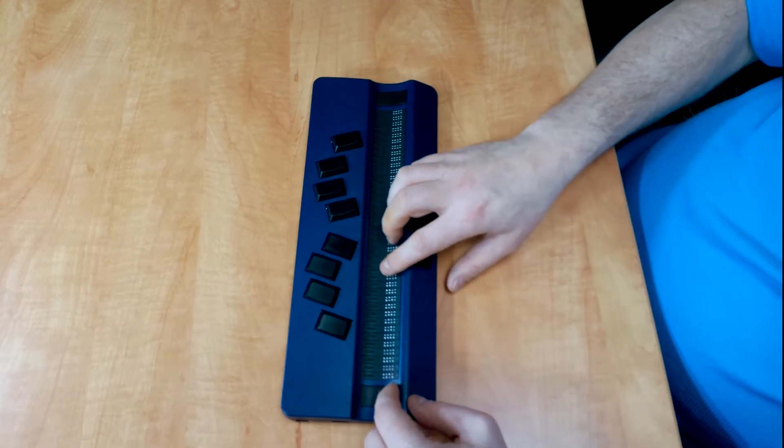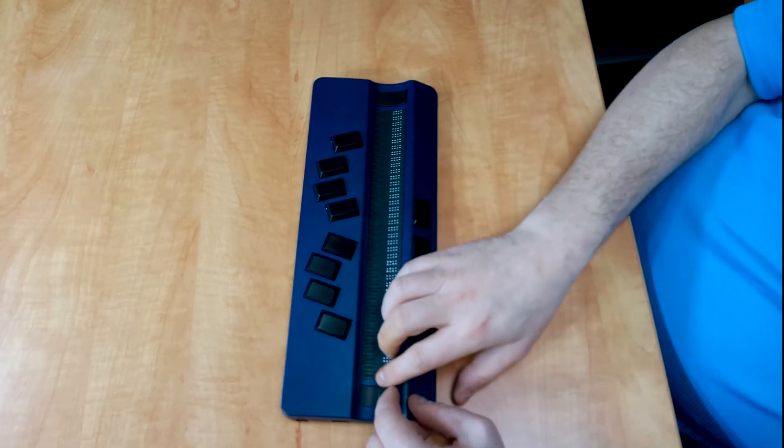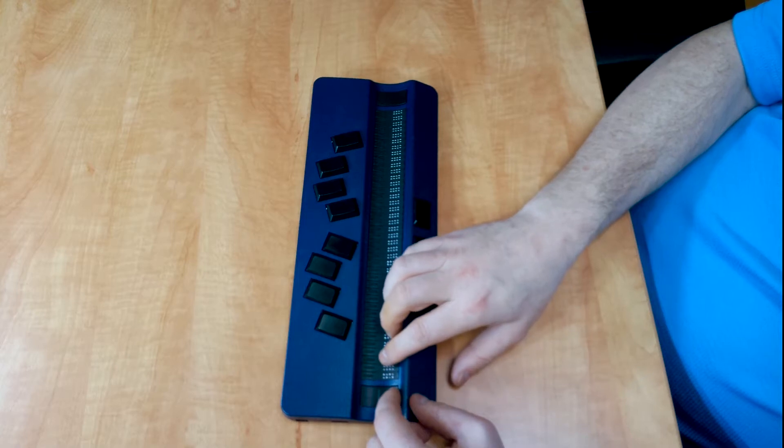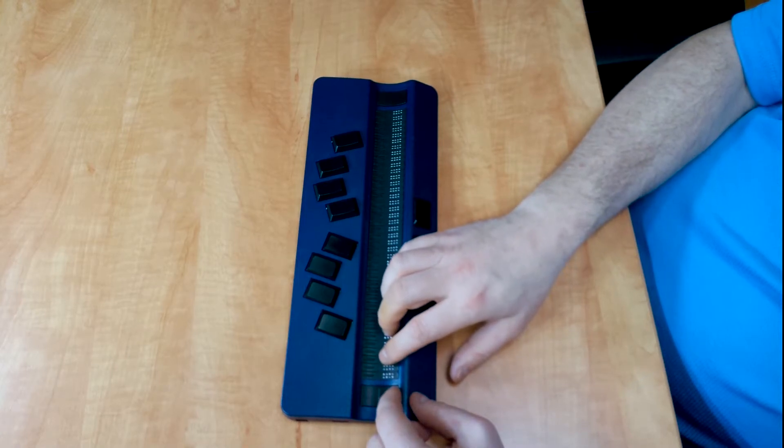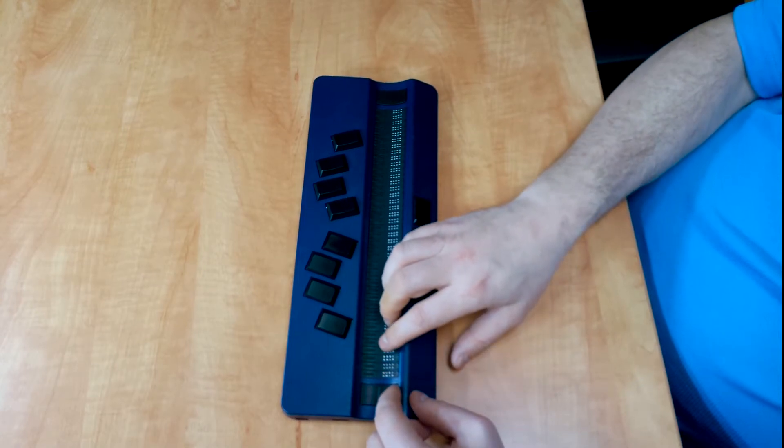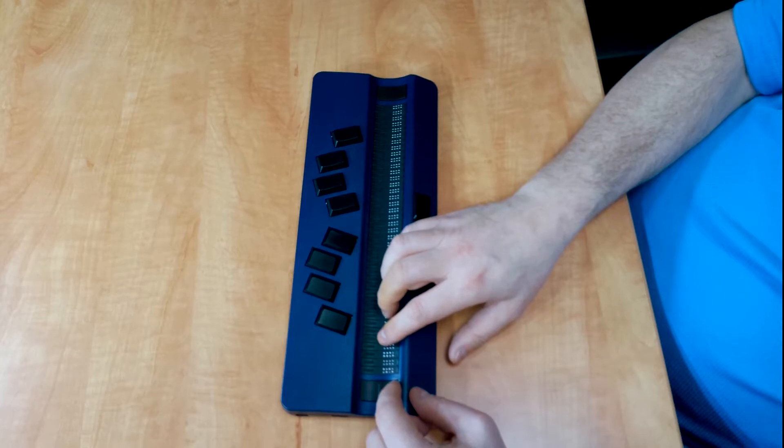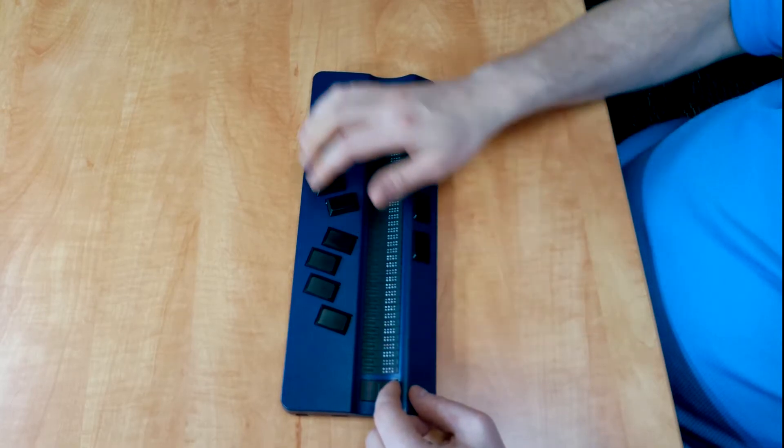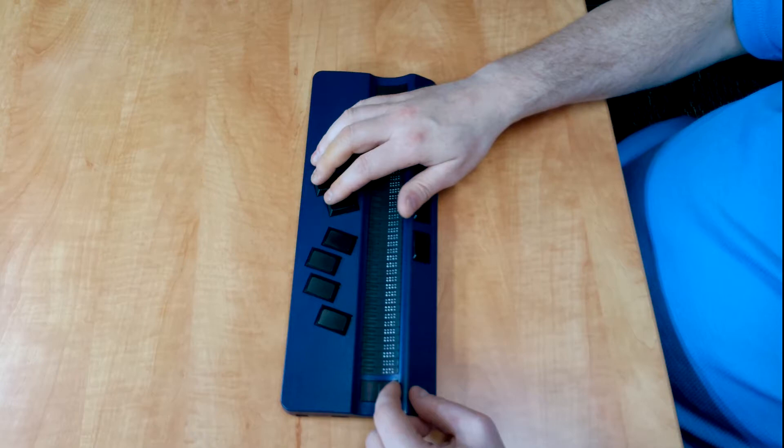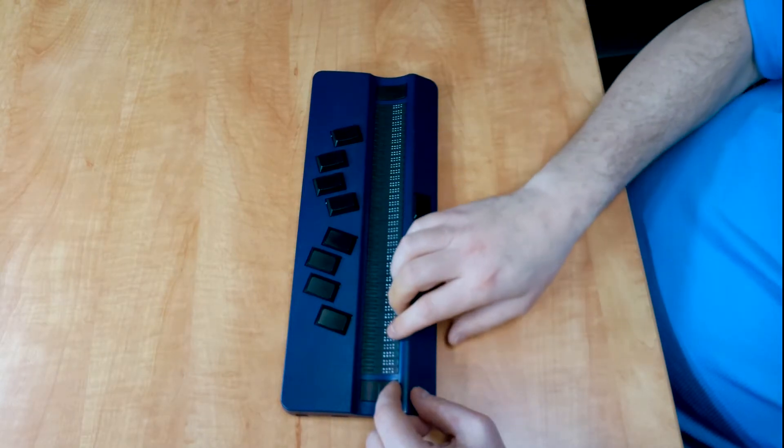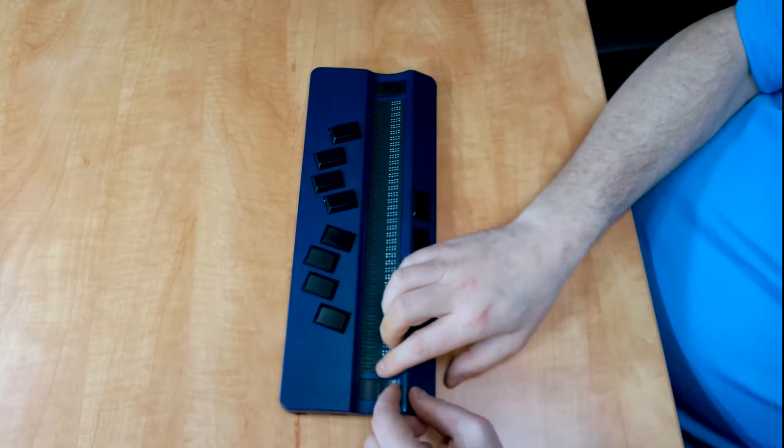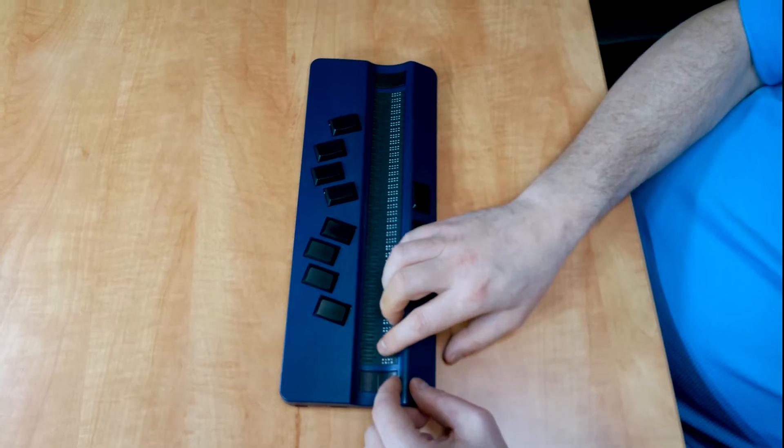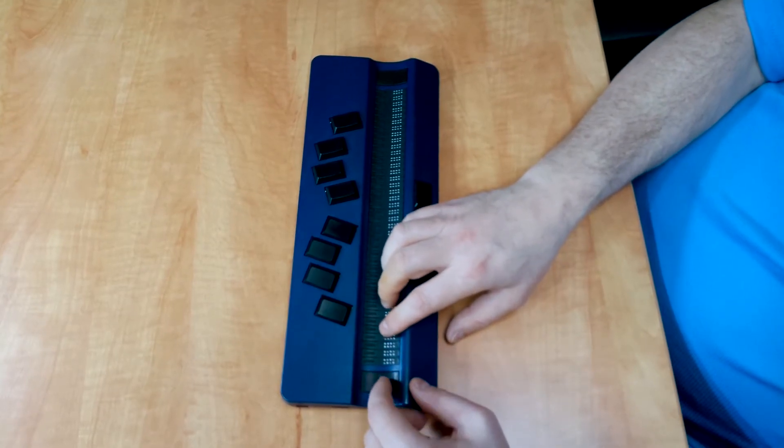So our Braille display now says Bluetooth On. But at the left hand side of the Braille display are a left bracket and a right bracket with a blank cell in between. This is a check box, so in order to turn Bluetooth on, we need to check it by pressing Enter or dot 8 on the Perkins keyboard. If you look at the Braille display now, you'll see that there's a Braille letter X in between the bracket. Bluetooth is now turned on.